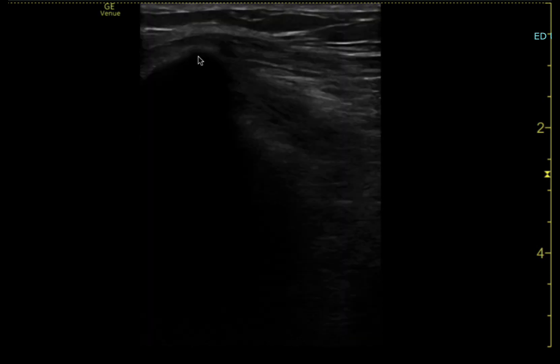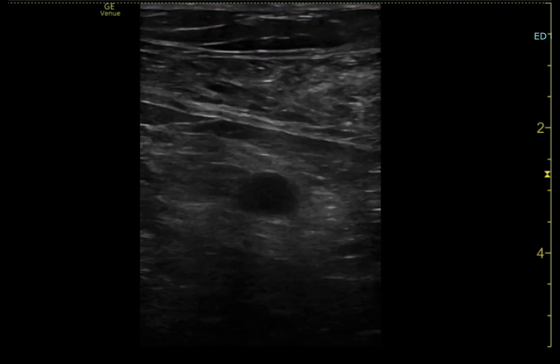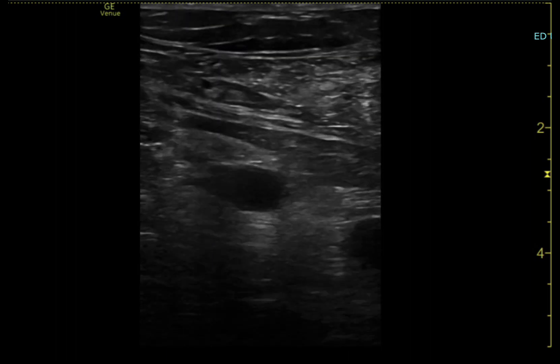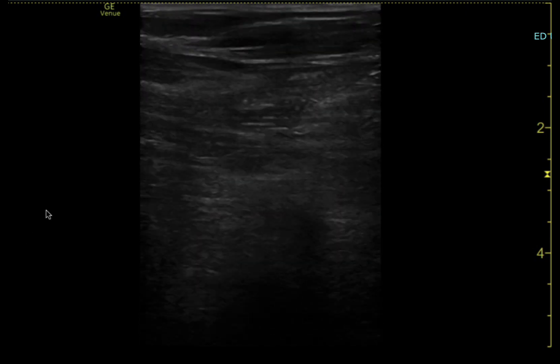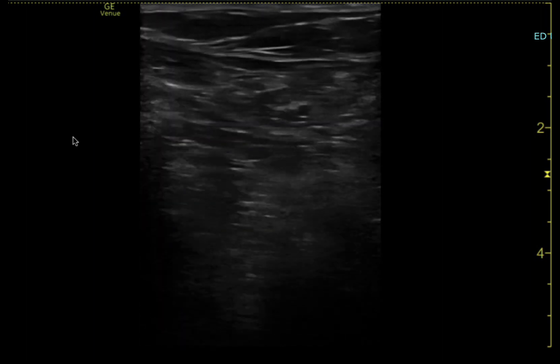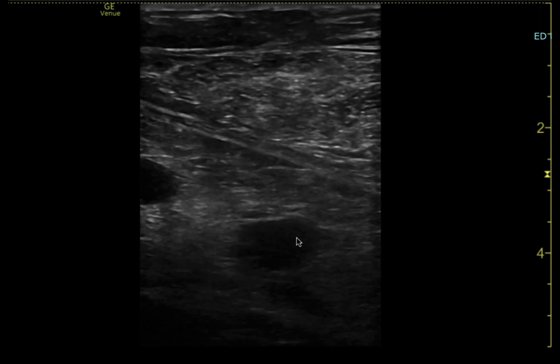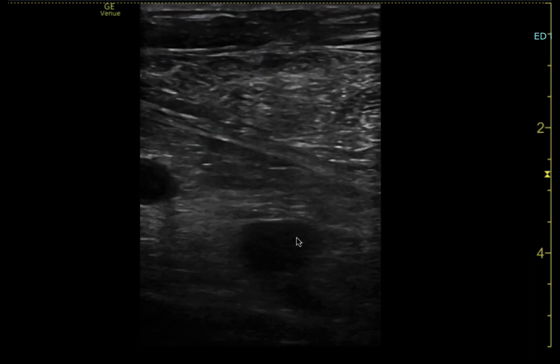I stick the probe in cross-section of the clavicle and then slide inferiorly towards the feet to find the subclavian vessels. In this case — this is a little unusual anatomically — the first thing we see is the artery. You should see it pulsing, it has a thick wall, it resists compression. Then a little more caudad we identify the subclavian vein. That's unusual — oftentimes the vein will be more superficial than the artery.